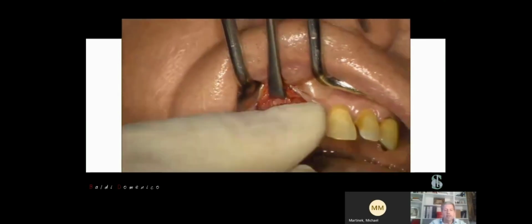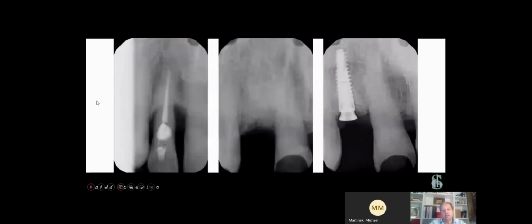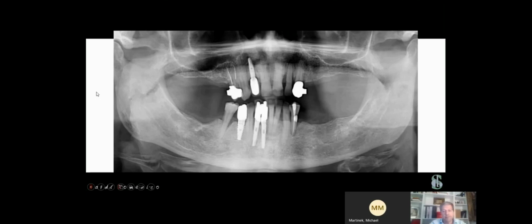And we can suture it. Then we can wait for the healing of the soft and the hard tissue. So we can see before the extraction, after the ridge preservation, after the implant site preparation with the mallet. You can see how it was possible to change the shape of our bone.